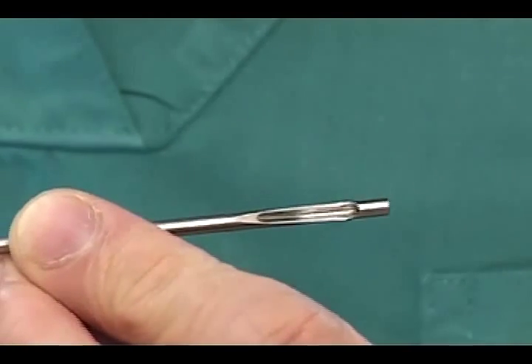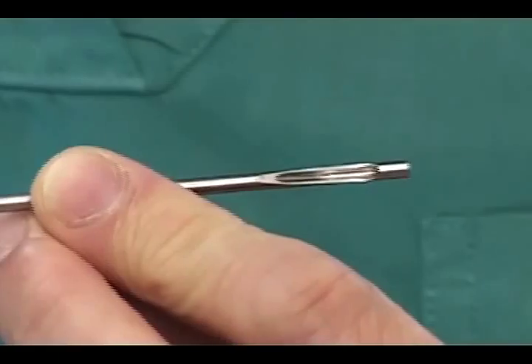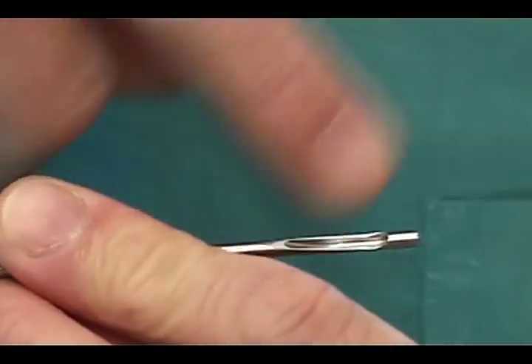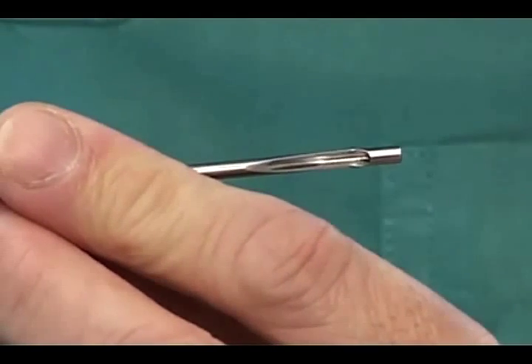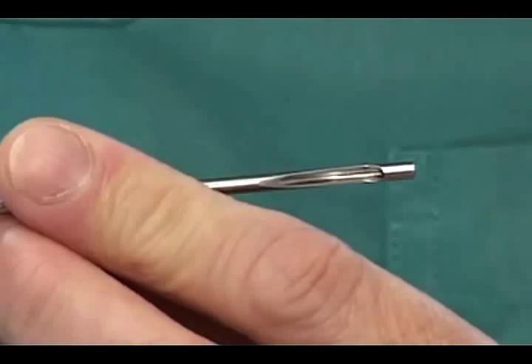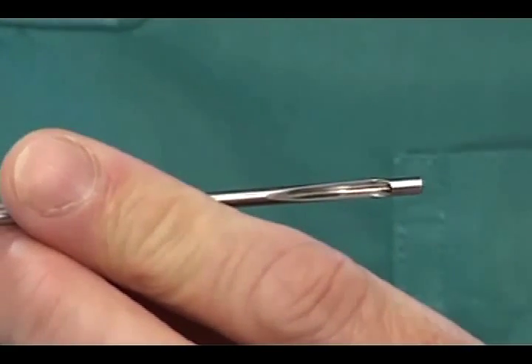This 3mm knot pusher is a very nice piece of instrument that I would strongly recommend. Because it has a totally encircled tip, it allows the knot to be pushed down to the target area without worrying that the suture may slip out, and it also minimizes the chance that tissues may get entangled in the suture while the knot is being pushed downwards.